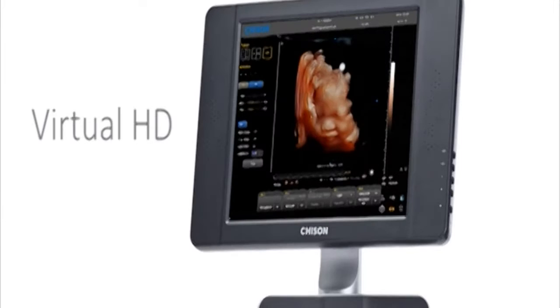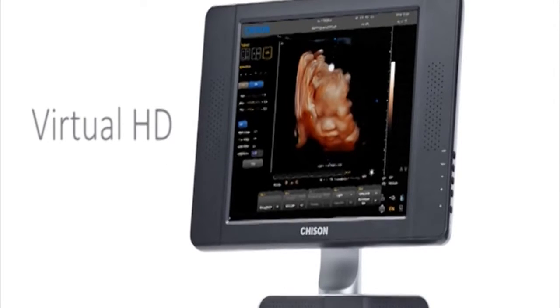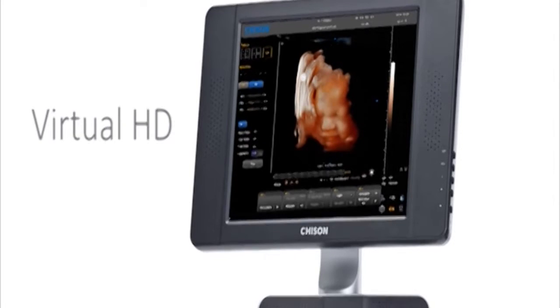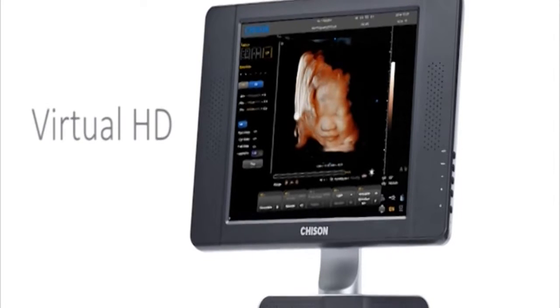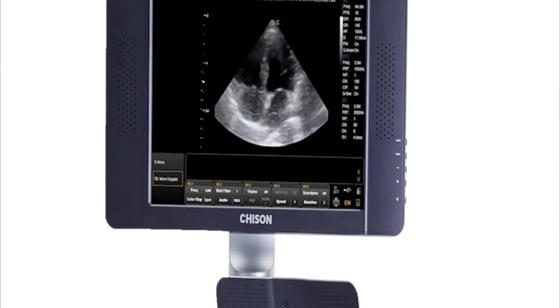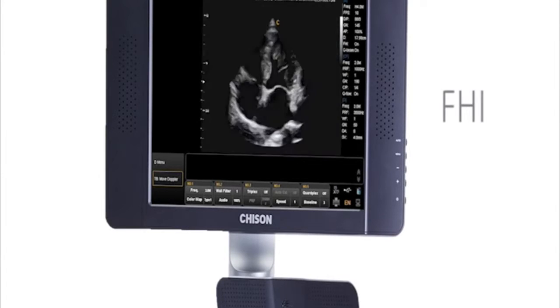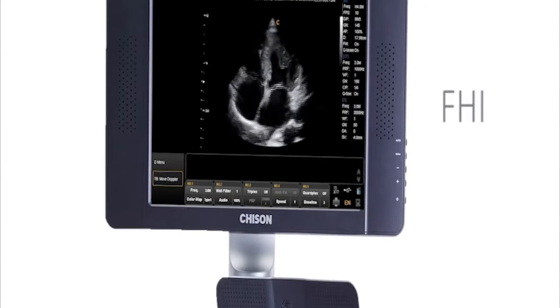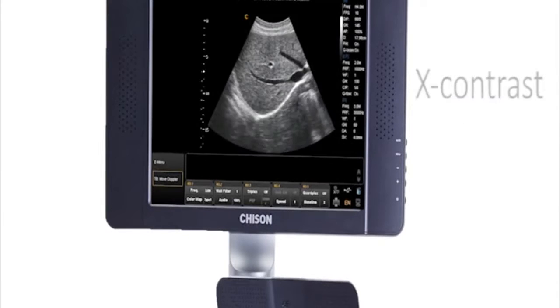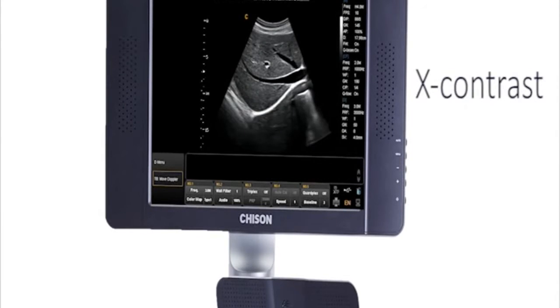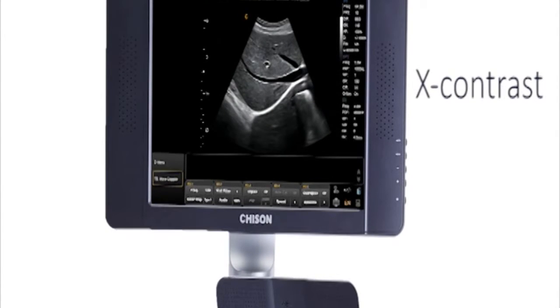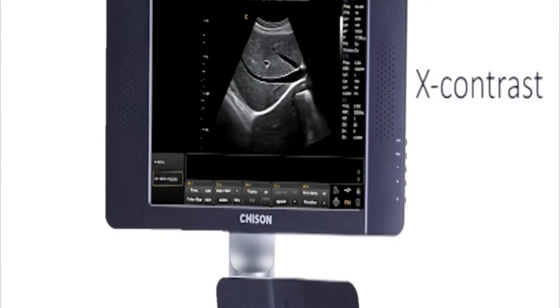Virtual HD by using movable light results from different directions to make the fetus's face more vivid. FHI, push this button to open it, especially for cardiac examination. X-contrast, push this button, specialized for liver scanning.